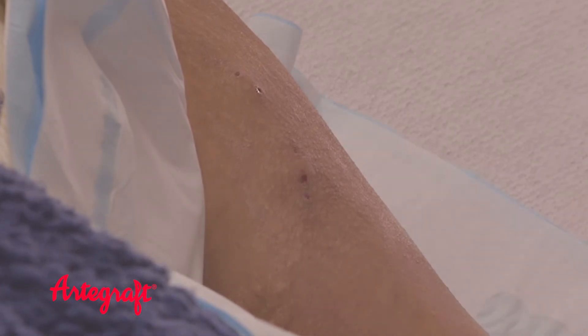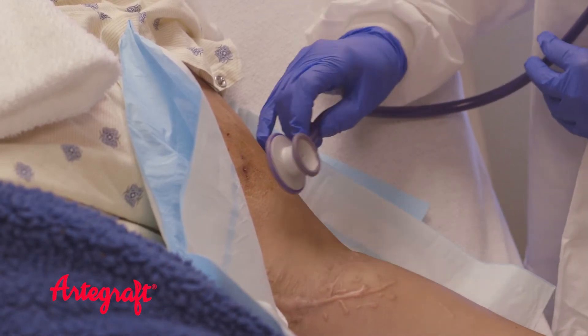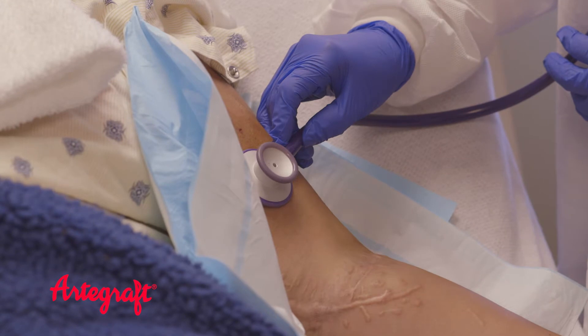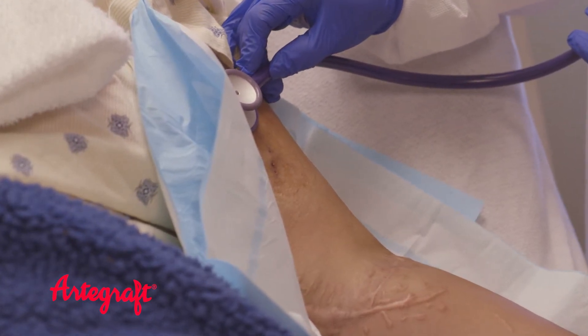Post-surgical edema or swelling must subside prior to cannulation. You listen for a normal, low-pitched, and continuous swishing sound — this is called the bruit. Make sure there are no abnormal sounds with increased pitch or a whistle-like sound.